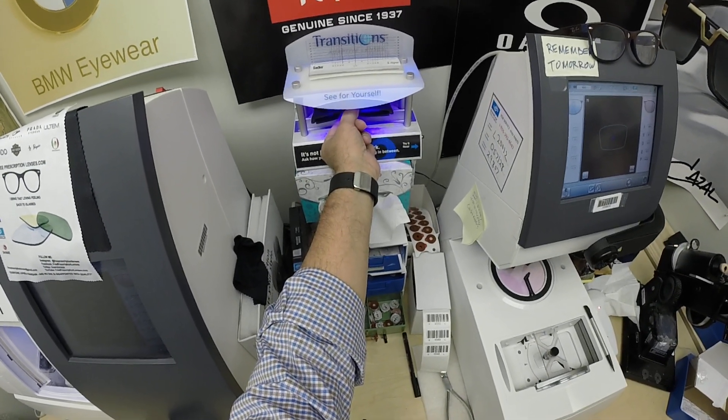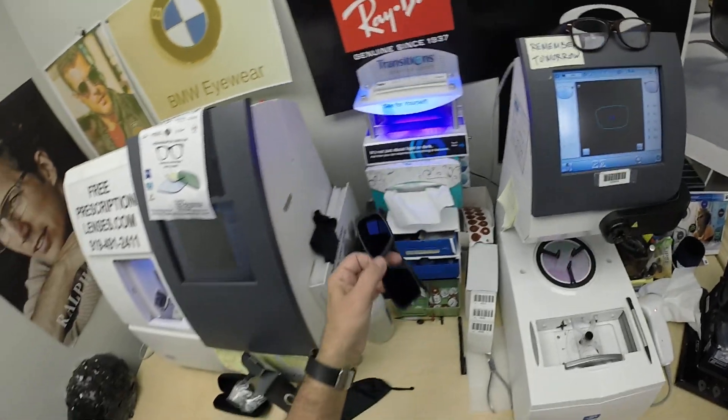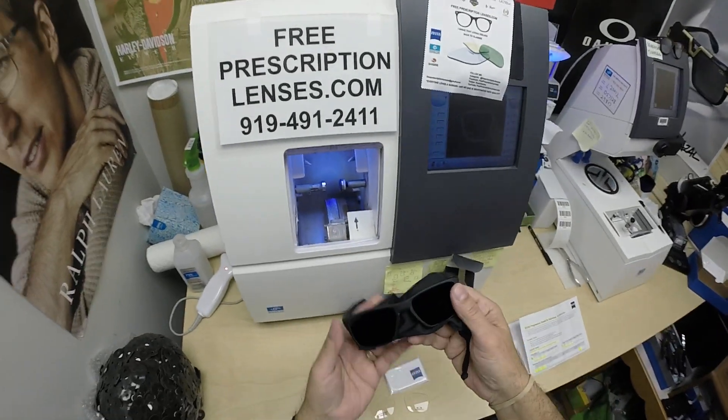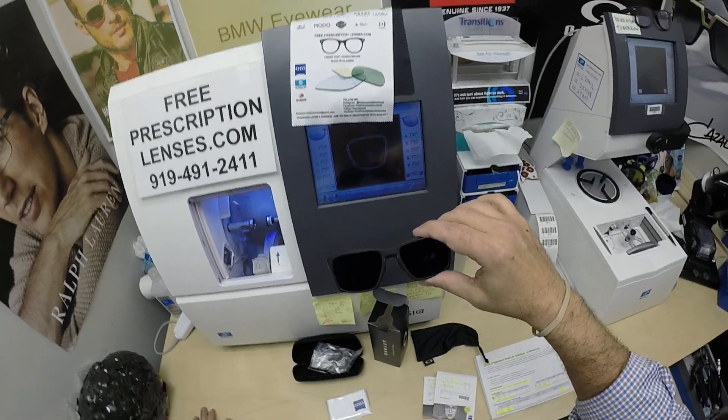Now if you have a convertible or a motorcycle, yes. Having said that, the Zeiss photo fusion extra gray will get 30 to 50% dark behind a windshield.